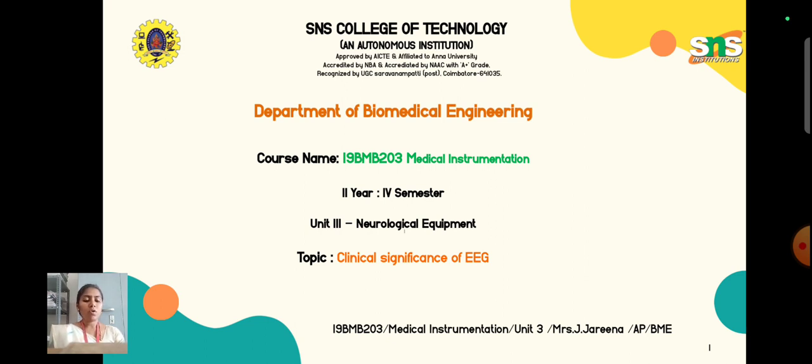As I already told you, there are three technical terms we used to get confused: electrocardiograph, graphy, and gram. Irrespective of any kind of electrical activity, whether it is ECG, that is the heart, or EEG, EMG, ERG, EOG, EGG, whatever it is, when the word ends with graph, it's an instrument.